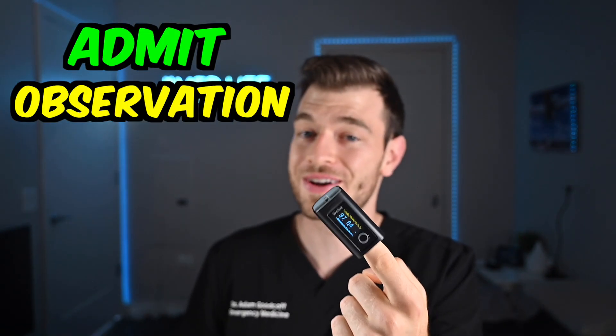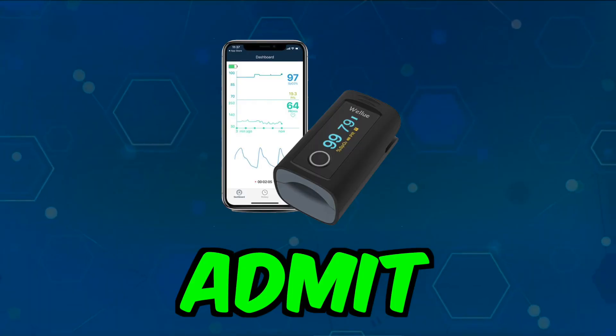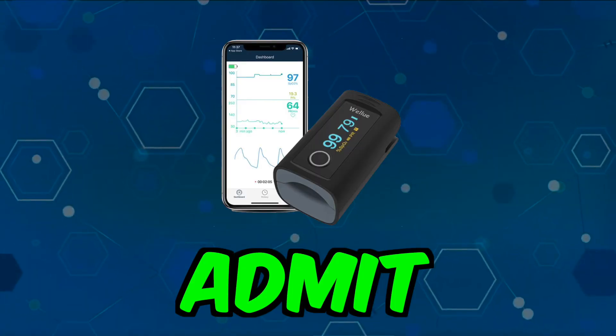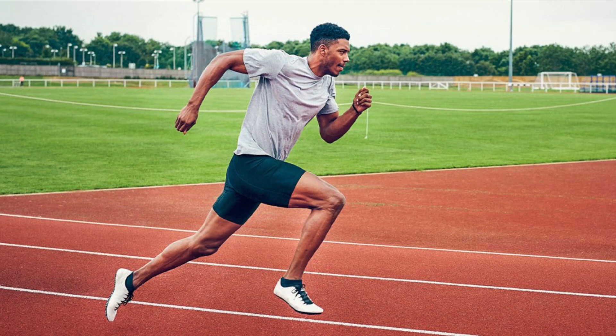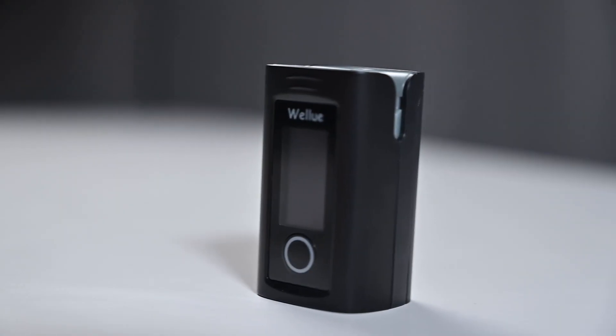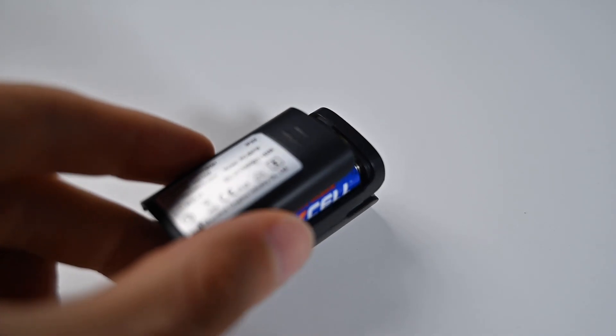My rating for this device — admit, observe, or discharge — this is actually an admit. I think this is really cool; I like having this. I've never had a pulse ox before. This could be really easy if you just want to do a quick check at the gym, or see if you get hypoxic when you run. You could bring this along, pop your finger in, and get a very quick reading. And it really saves the battery — it turns right off.